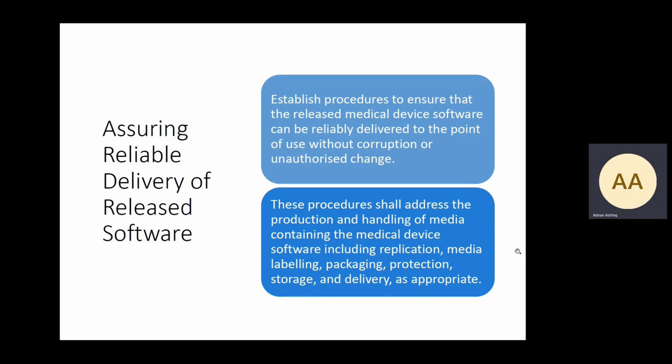These procedures shall address the production and handling of the media containing the medical device software, including replication, media labeling, packaging, protection, storage, and delivery as appropriate. And don't forget that even although we are software, there's also e-labeling and e-IFUs and all these types of things that are important. The protection and storage and delivery is probably less important if it's software which is being saved by a cloud or any other media like this, where unless there's CD-ROMs or DVDs or this type of thing that's being used, then there's more question around packaging and protection and storage.